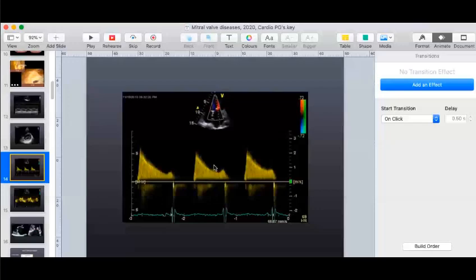So the pressure half time method to calculate mitral valve area. Do you think mitral regurgitation will be an element which can cause problems? Not acute MR. Okay, what I'm trying to convey is that if you look at the slope, primarily you're looking at the slope, isn't it? So the more the slope is flattened, the more severe the stenosis. Now, if you have a lot of aortic regurgitation, severe or more than moderate aortic regurgitation will increase the LV filling pressure, the LVEDP. So then this will have an effect on the slope.